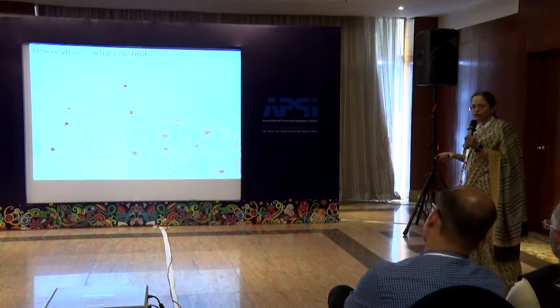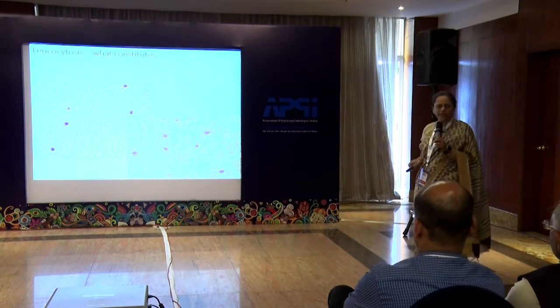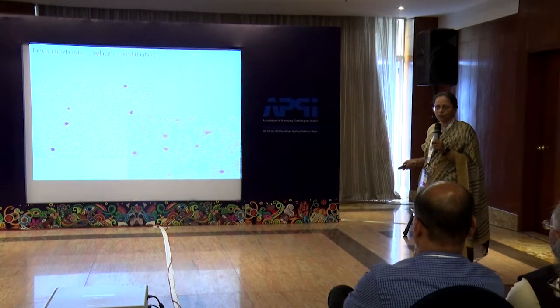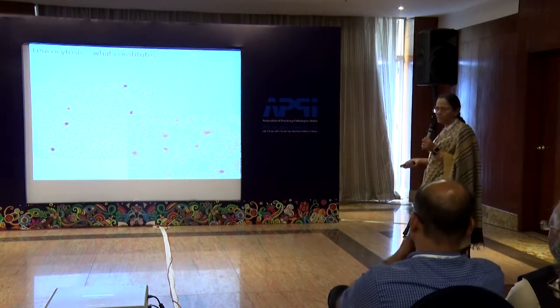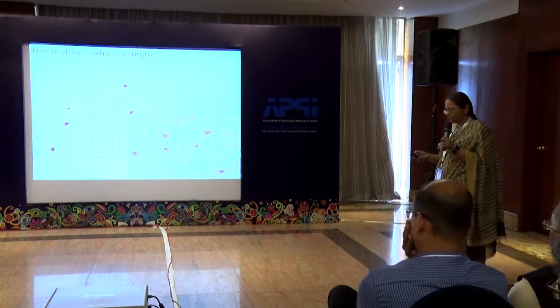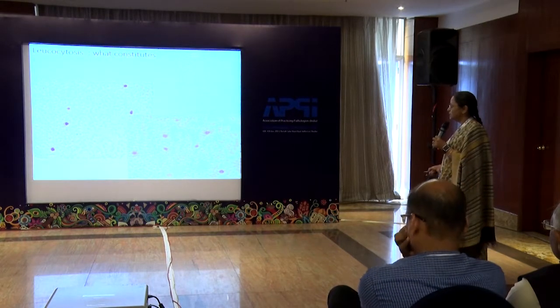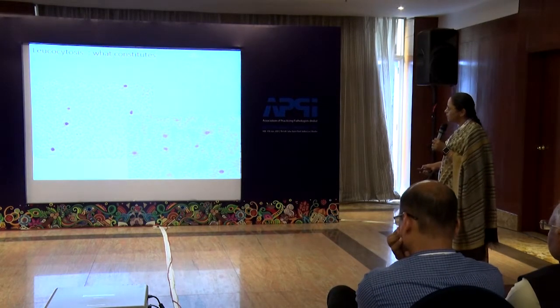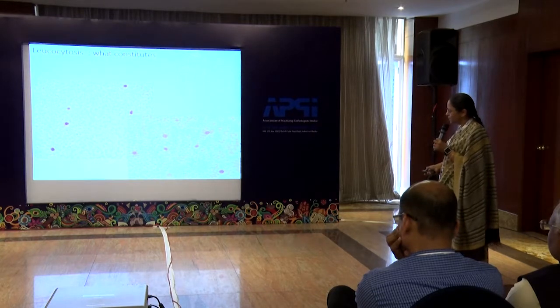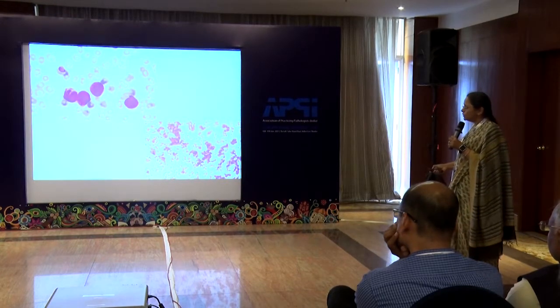Now, how about leukocytosis? All leukocytosis is not the same, and definitely it's simpler than leukopenia, but looking at the smear makes all the difference to know which component is leading to leukocytosis. This one is blast, this one is blast, these are lymphoid cells. So the line of thinking, the diagnostic approach, is different. This one is leukocytosis with these, what are these cells?